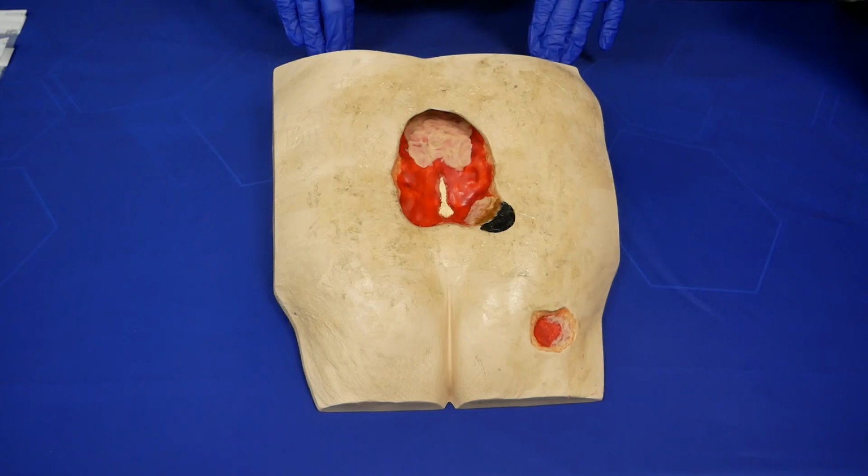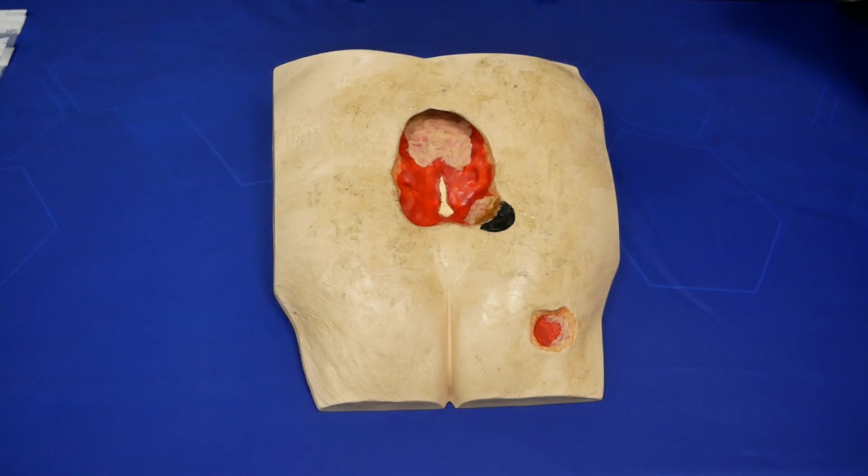Before we begin with our application, a couple key points to remember is that we have already correctly identified our patient. We've double-checked our physician's order. I have already pre-prepped my workstation, and the wound and peri-wound both have been cleansed per order, and the skin prep to the peri-wound has also been applied per order.